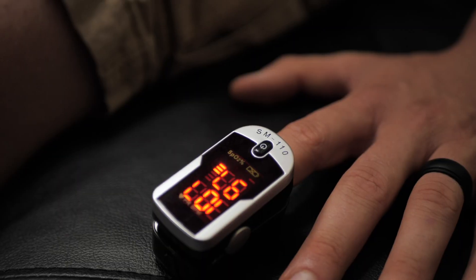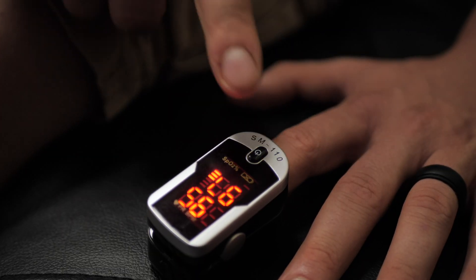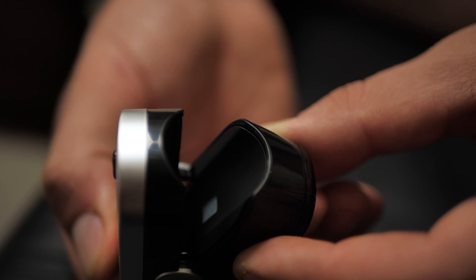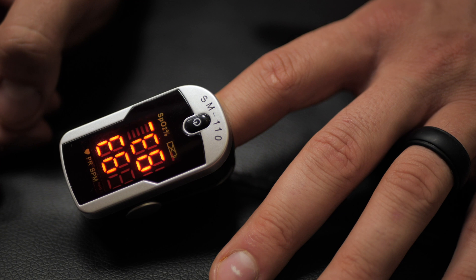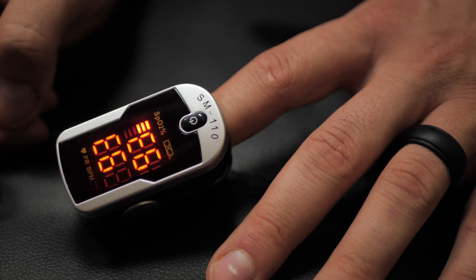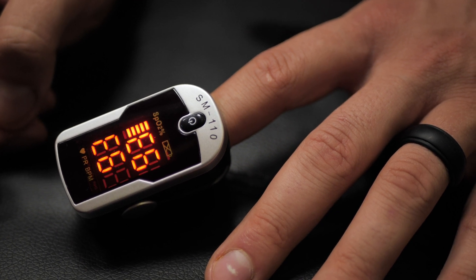How do we measure oxygen saturation? We're going to use a tool called a pulse oximeter. This pulse oximeter uses a couple of different lights shining through your nail bed, and based on the color of your blood it gets an approximate count of how many hemoglobin in your blood have oxygen attached to them. You'll get a percentage readout like 98% or 96%. If it drops into the 80s or 70s, we need to give supplemental oxygen to get back up into the 90s.